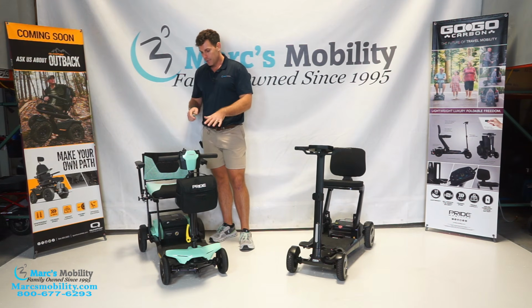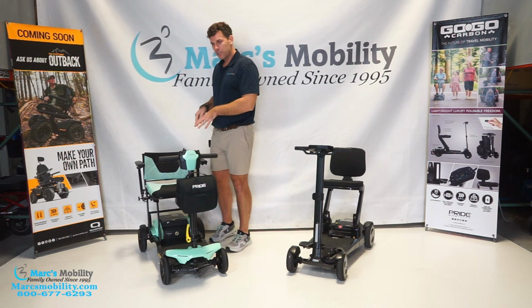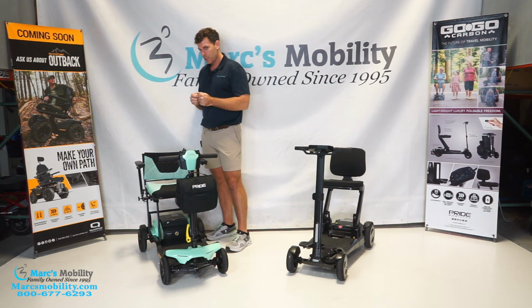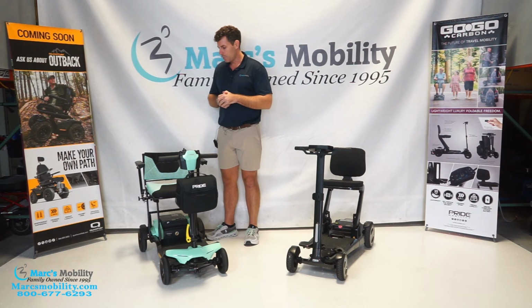Now the unit is going to fold a little bit more compact, but it is going to be a longer unit. And then I guess a con on this unit would be that when you are in that folded position and you want to roll it around, there is going to currently be resistance on the motors, even when you are in a freewheel position.